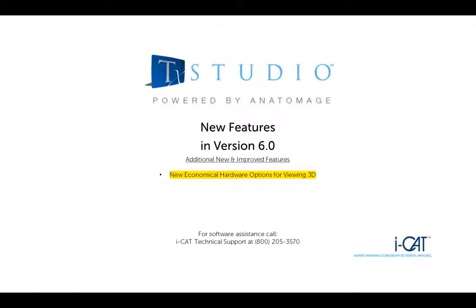The minimum requirement is an Intel HD 4000, although an Intel Iris Pro option is more preferred. AMD and NVIDIA cards are still viable higher-end options.